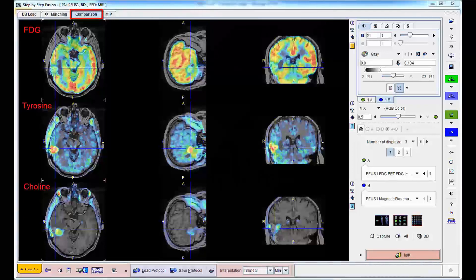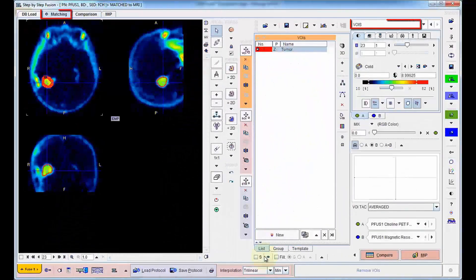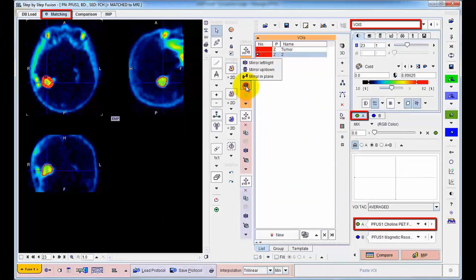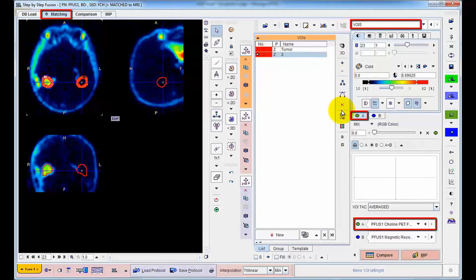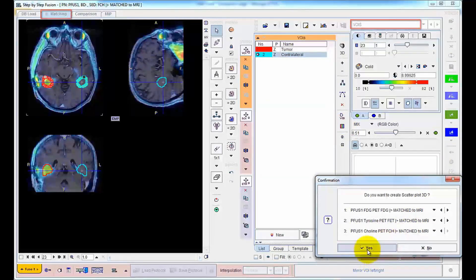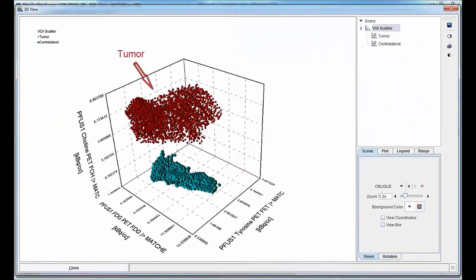FUSE-IT provides various ways to study the joint information contained in registered images. The approach illustrated here correlates the tracer uptake across the PET studies. A tumor volume of interest is outlined using the choline PET. To obtain a comparison reference, it is mirrored contralaterally to healthy tissue. Next, the uptake across the PET studies in all VOI pixels is calculated, and the result is visualized as an interactive 3D scatterplot. Note how the cluster representing tumor tissue is clearly separated from the reference, mainly in the dimension of the choline uptake.